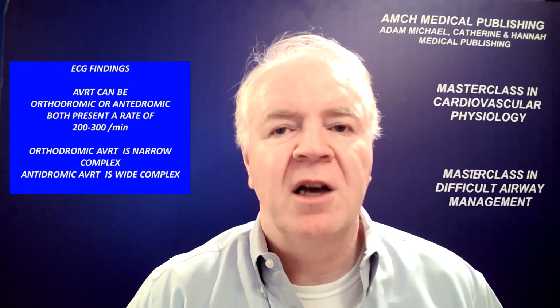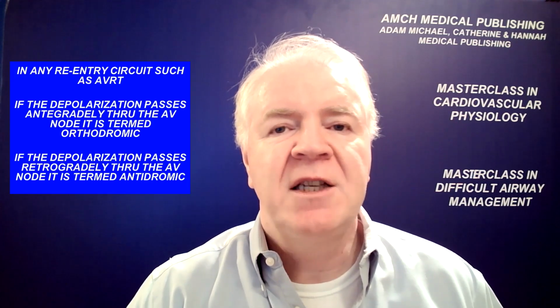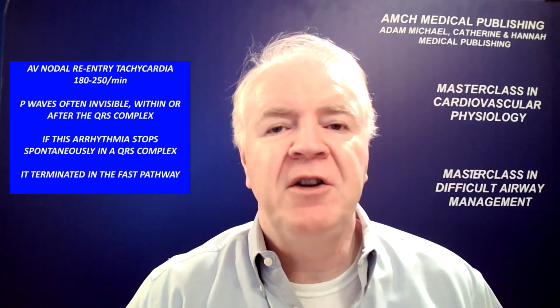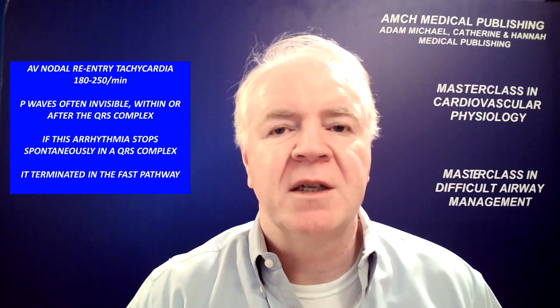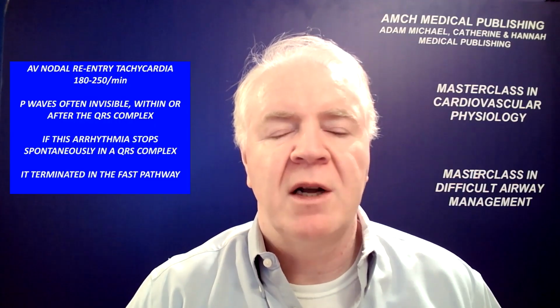Now, clinical features on the EKG. In orthodromic AVRT, the ECG shows a narrow complex tachycardia at 200 to 300 beats per minute. In the antidromic AVRT, the QRS is a wide complex at the same rate. In AV nodal reentrant tachycardia, this is narrow complex at 180 to 250 beats per minute. The P wave may be invisible, hidden within the QRS, but sometimes it occurs immediately after the QRS.